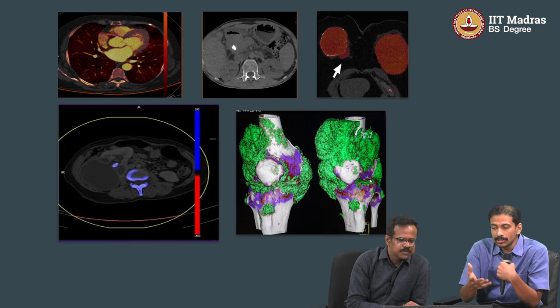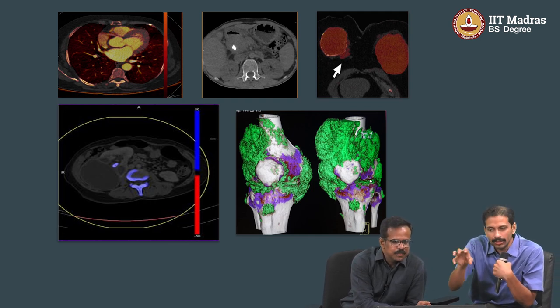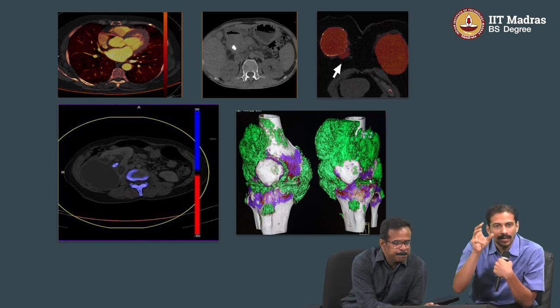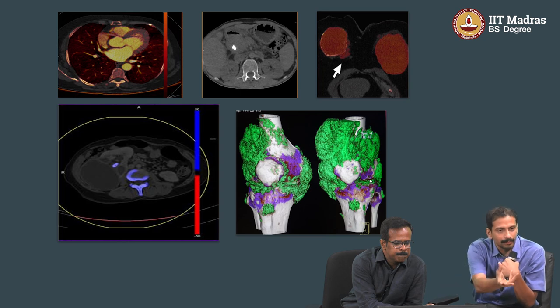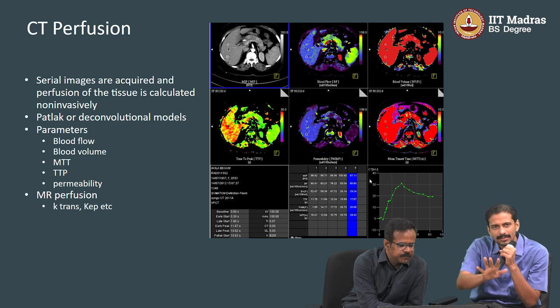What is the need? Because each patient's anatomy is different. Okay, now we have these VRT volume rendered images of the particular anatomy. You want to replace this. So this can be converted into an STL file. This particular data can be directly converted into an STL file. STL, if you understand, right? The 3D printing source file. And once you have this converted to an STL file, it can be 3D printed.